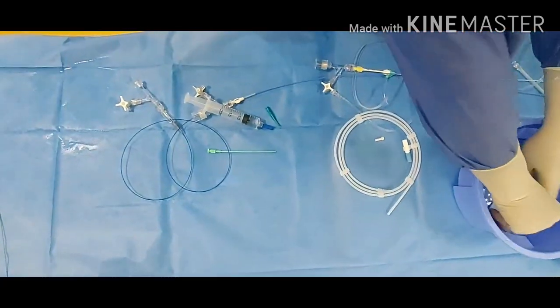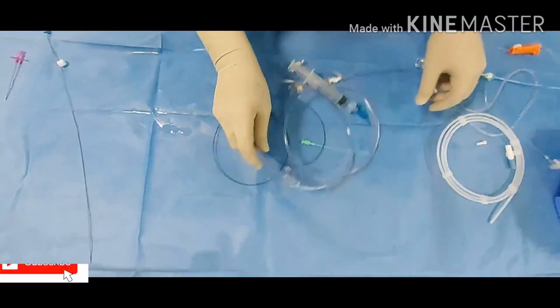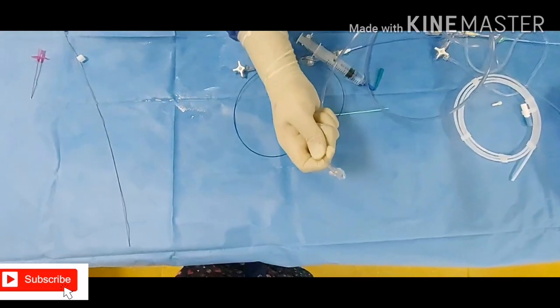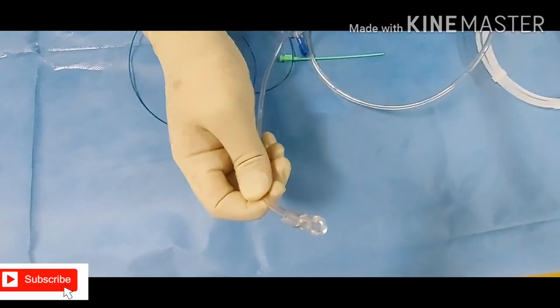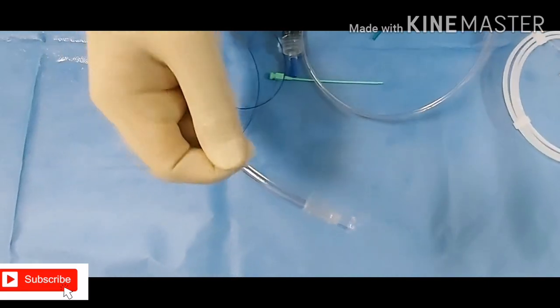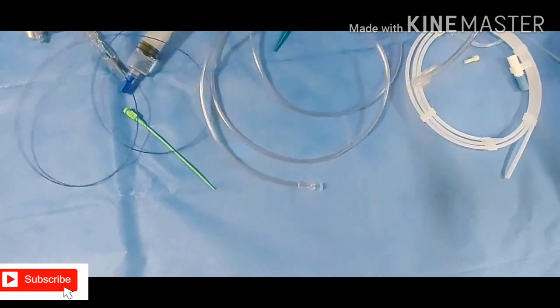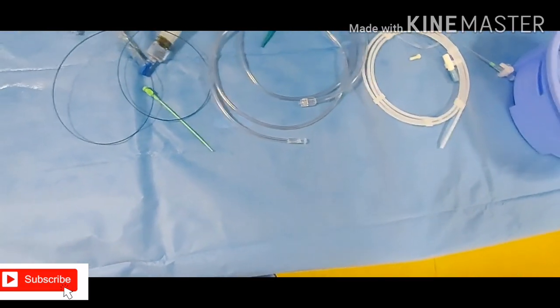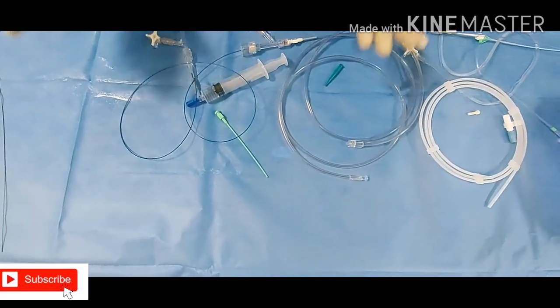This is the injector — always give the female side to the patient side and to the technician so that he can connect it to the injector. This end goes into the patient side. Always make sure that it is clamped. Hope you understand — if you have any doubts, thank you so much.